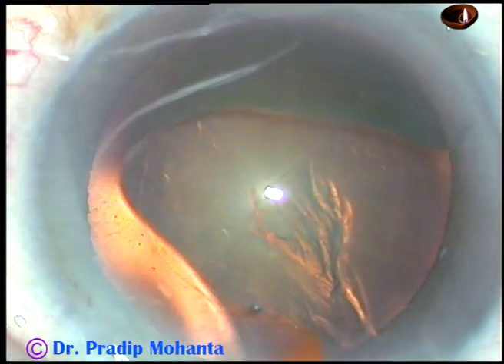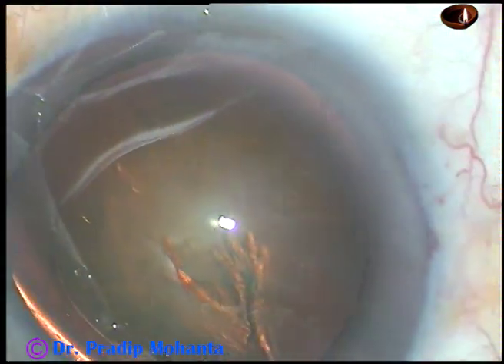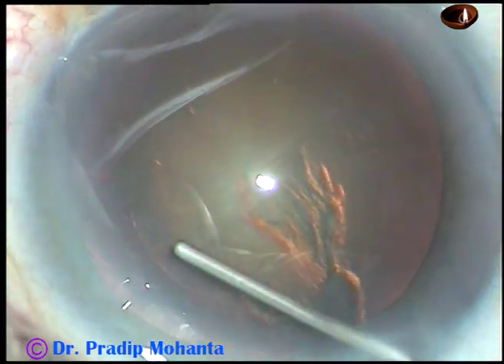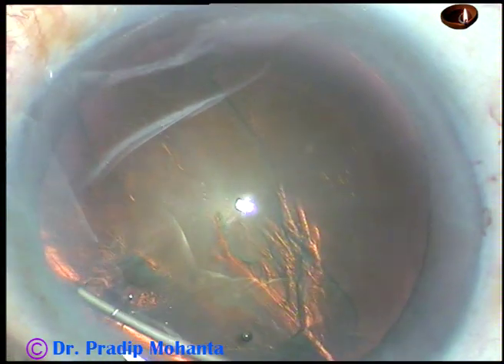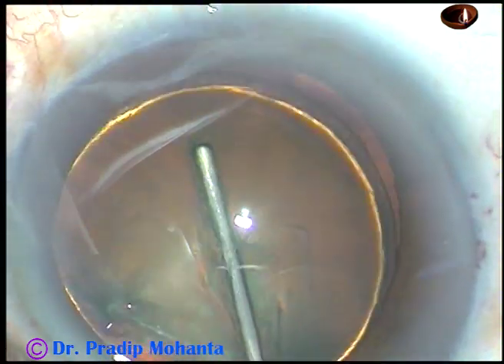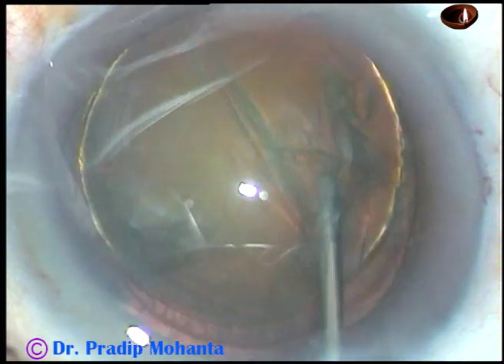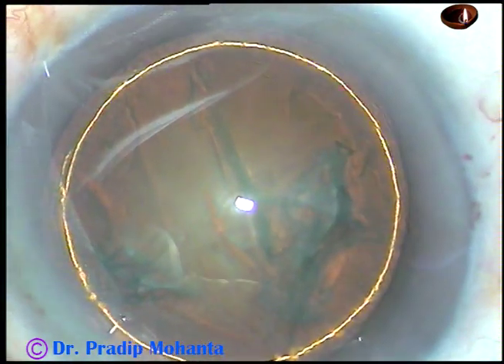And now hydrodissection — BSS is passed just under the anterior capsular rim. Here it is. BSS is passed, the fluid wave goes to the opposite equator. Hydrodelineation is also done, passing the fluid wave between the nucleus and epinucleus.